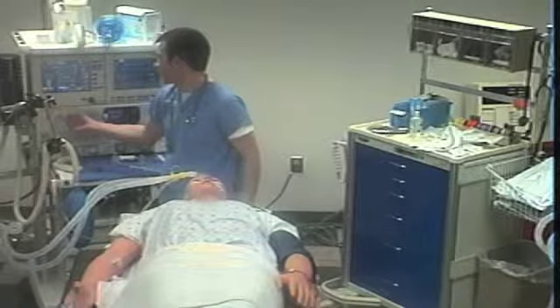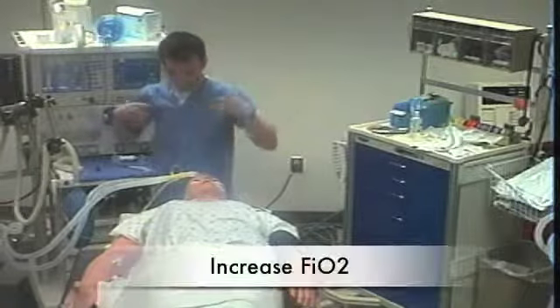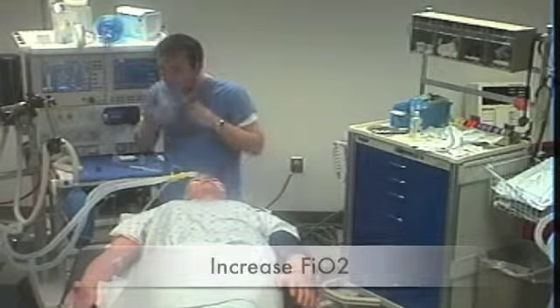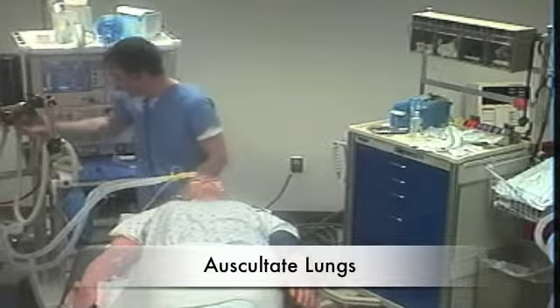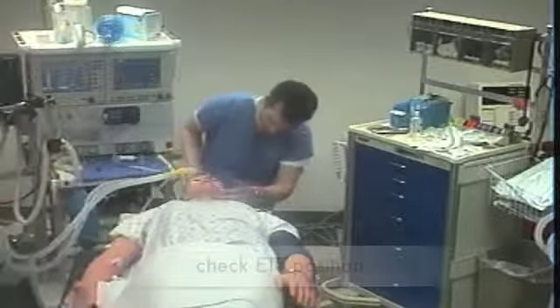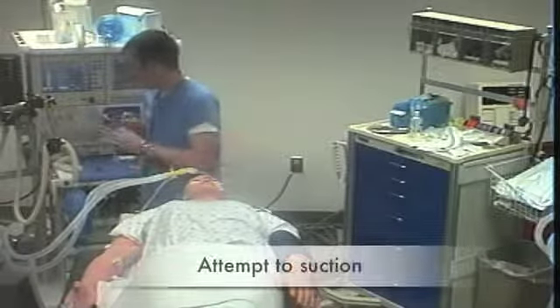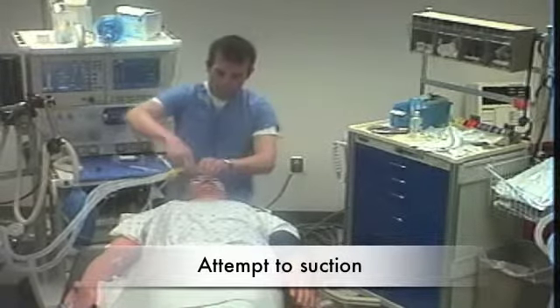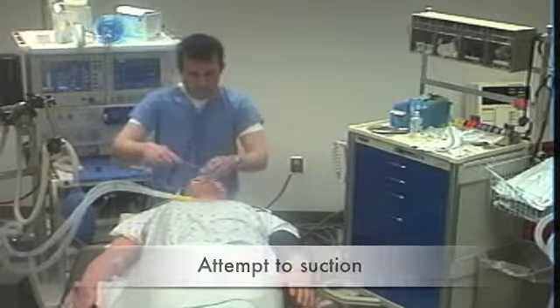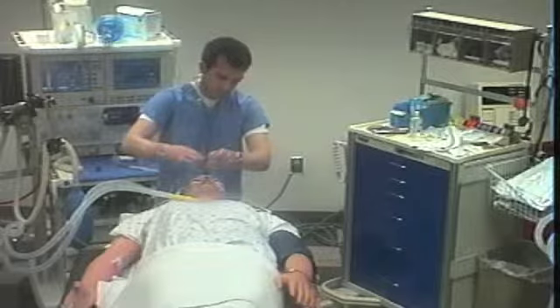Starting with the patient, work your way back towards the machine. First, increase your FiO2 to 100%. Then listen to breath sounds. In this instance, no breath sounds are noted. Then check your ET tube position. Attempt to pass the suction catheter down the ET tube to check for and aspirate a mechanical obstruction. Resistance is met and the catheter cannot be passed down the ET tube.